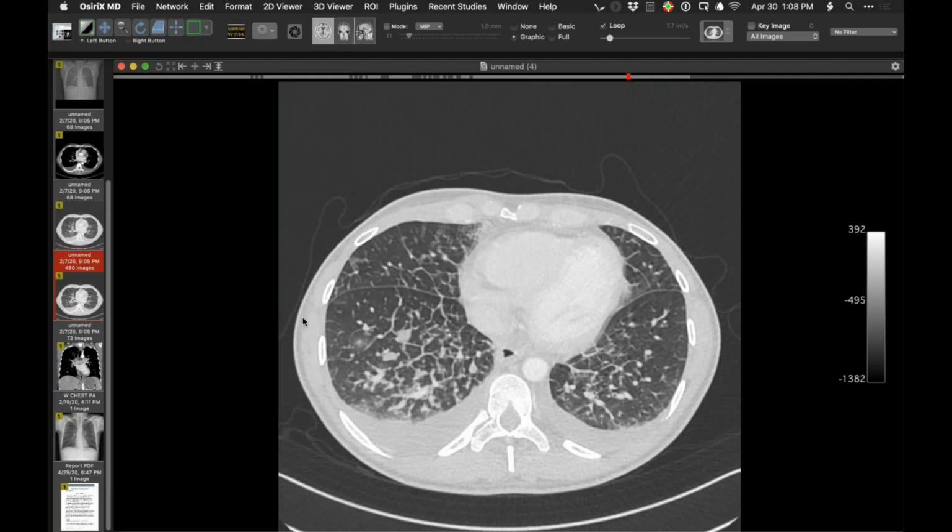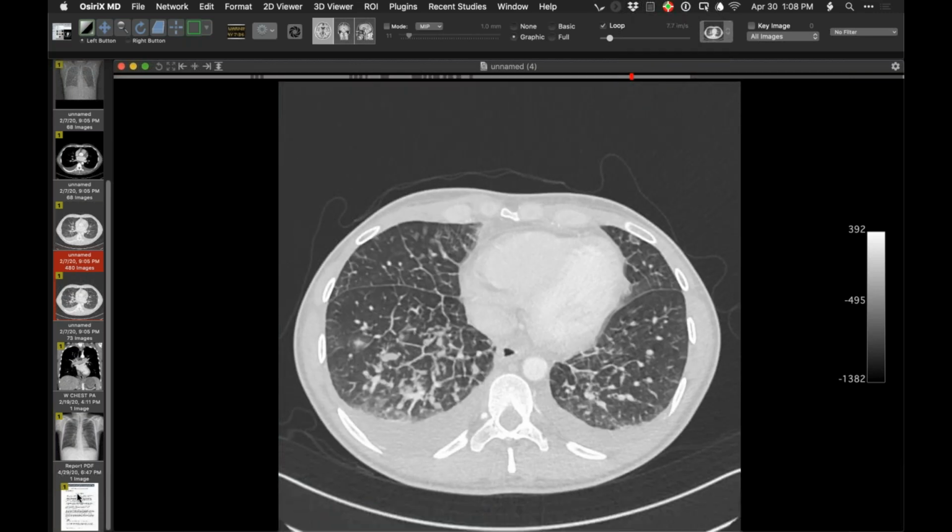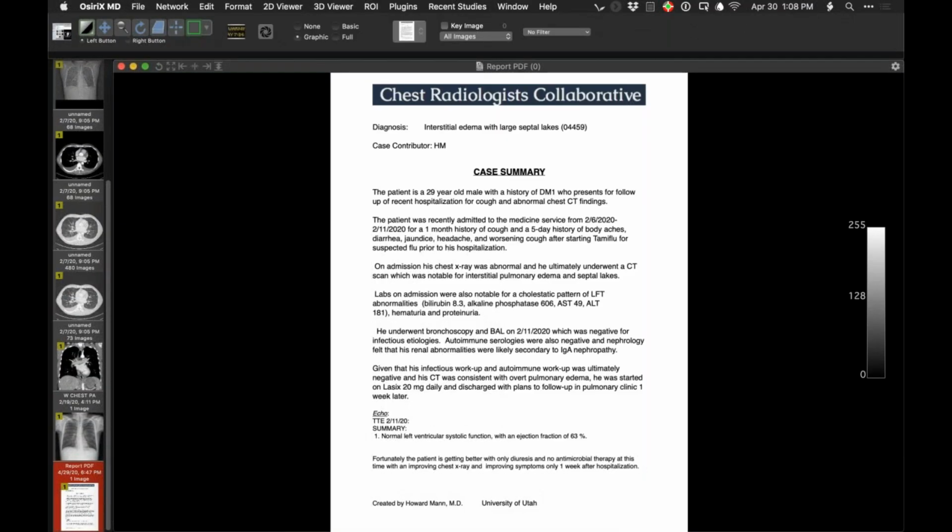So things like that. Howard, I wonder if he could have heart failure with preserved ejection fraction. I don't know. He's way too young, right? Which I think actually more so diabetes. Pardon? I think heart failure with preserved ejection fraction is actually more closely associated with diabetes. So maybe a possibility to explain it, but maybe they would have it on the echo. Yeah, I don't know. It's a pretty dramatic imaging appearance, huh?